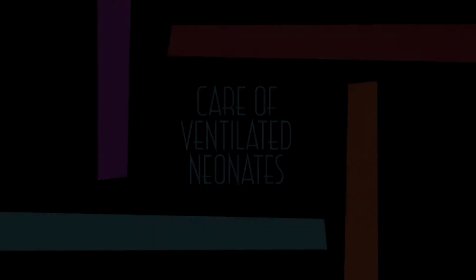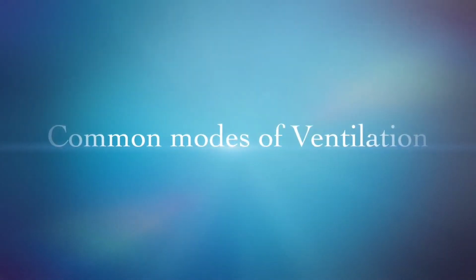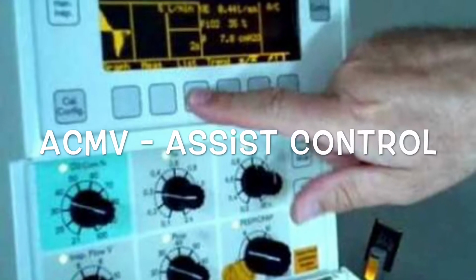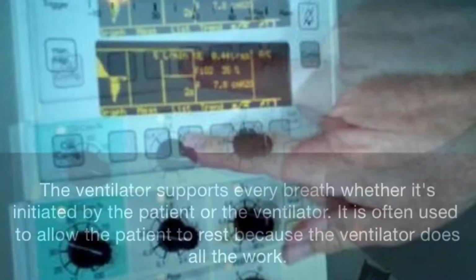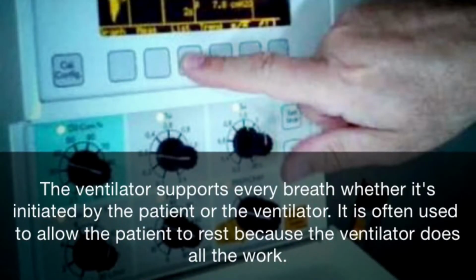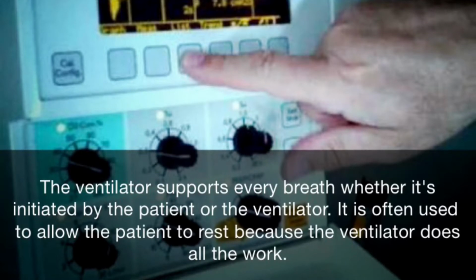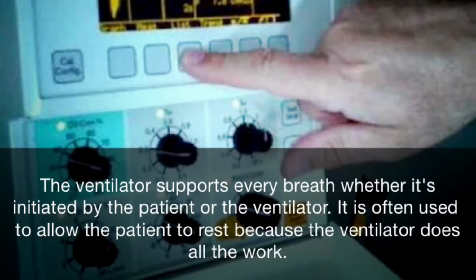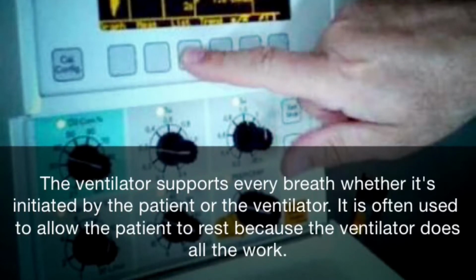Care of ventilated neonates. First, we have to know what the common modes of ventilation used in neonates are. Number 1 is AC mode or assist control mode. In this mode, the ventilator supports every breath, whether it's initiated by the patient or the ventilator. It is often used to allow the patient to rest because the ventilator does all the work. Inspiratory time should be at least 0.3 to 0.35 seconds.